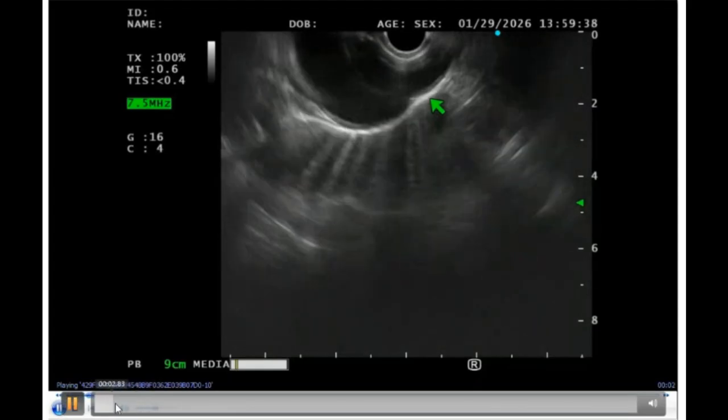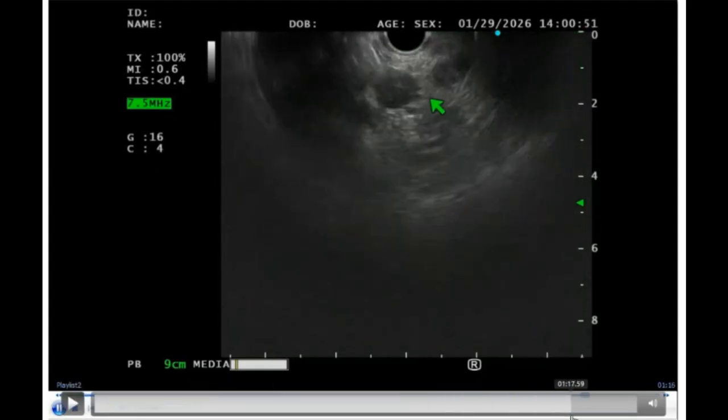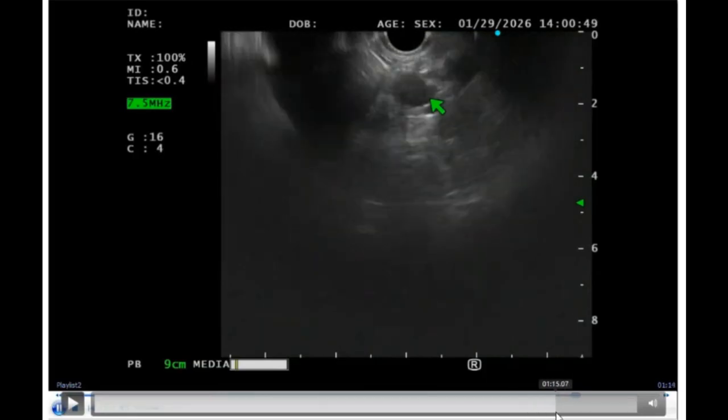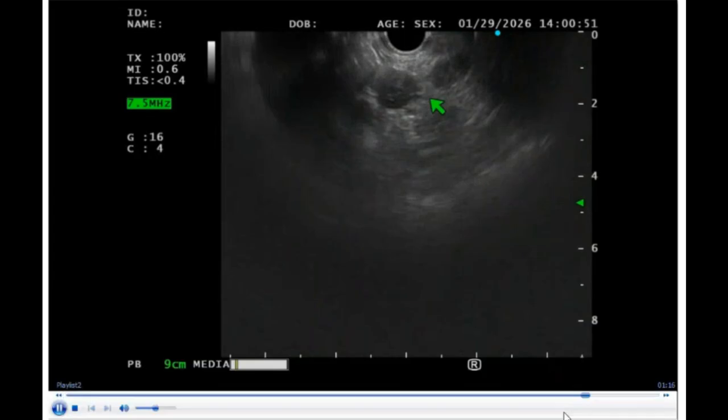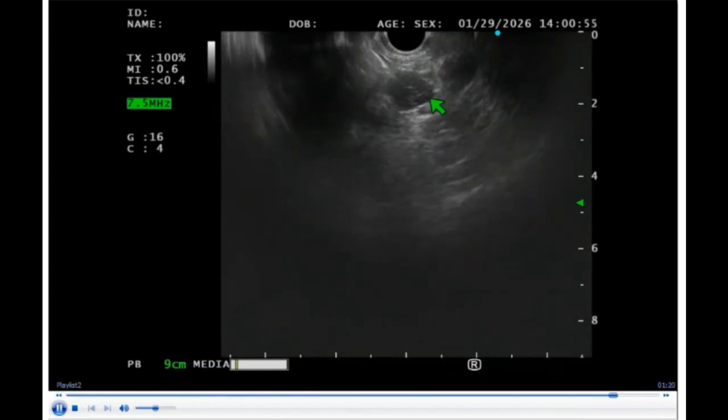Finally found this window here. So this is the window that was used and accessed, and turns out it was a squamous cell cancer, which is similar in morphology to her vulvar cancer, and HPV positive. Very, very rare presentation of a vulvar cancer to go into the left supraclavicular area.